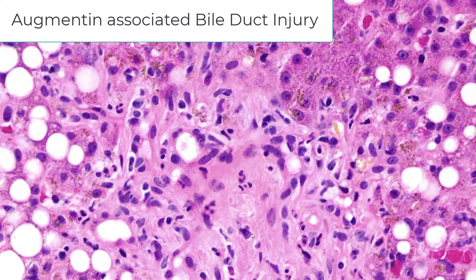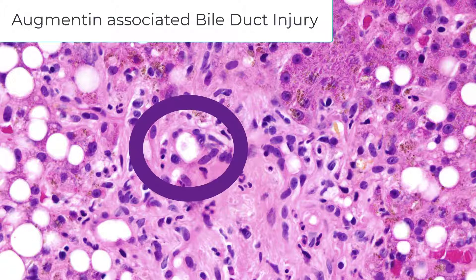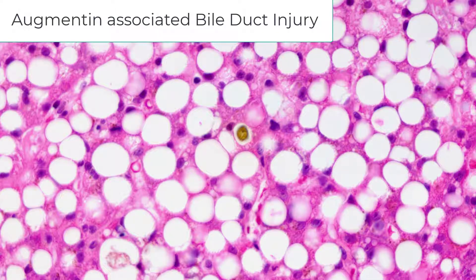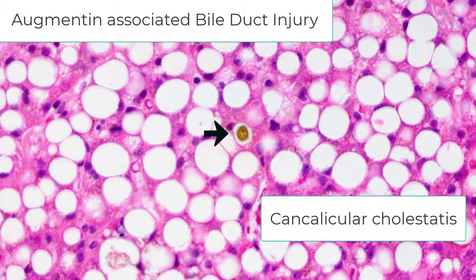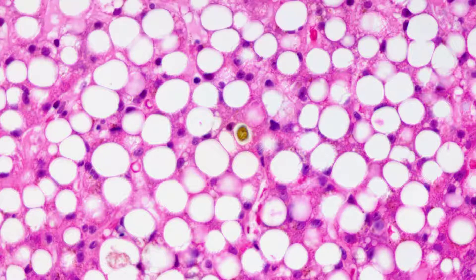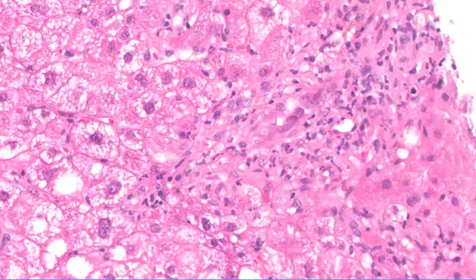This is drug-induced biliary injury. Notice that the bile duct shows significant damage. Drugs can potentially do anything in the liver, and you must consider drug-related injury whether it be a primary biliary destructive disease or a primary hepatitis. Perhaps the best way to distinguish PBC from drug-related bile duct injury is to look for cholestasis. In most cases of acute cholestatic drug-related liver injury, you will see bile plugs. In PBC, on the other hand, you will not see bile plugs until the late phase of the disease — so in early PBC, bile plugs are absent.